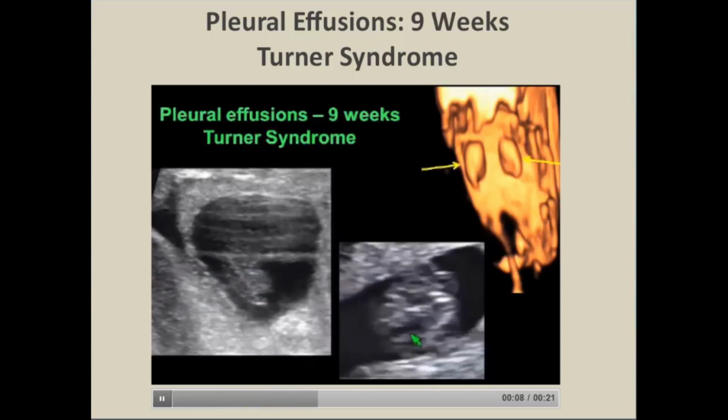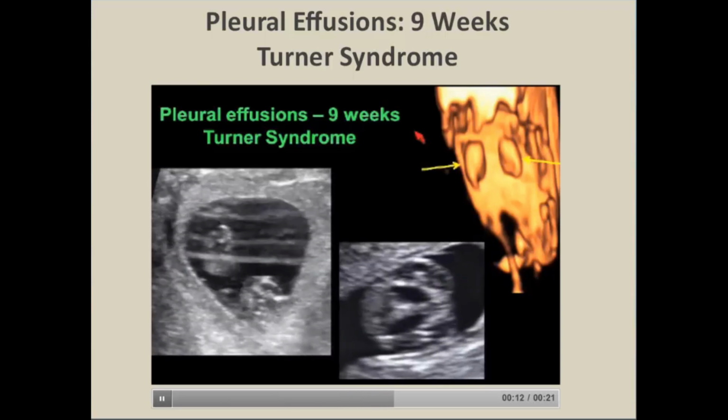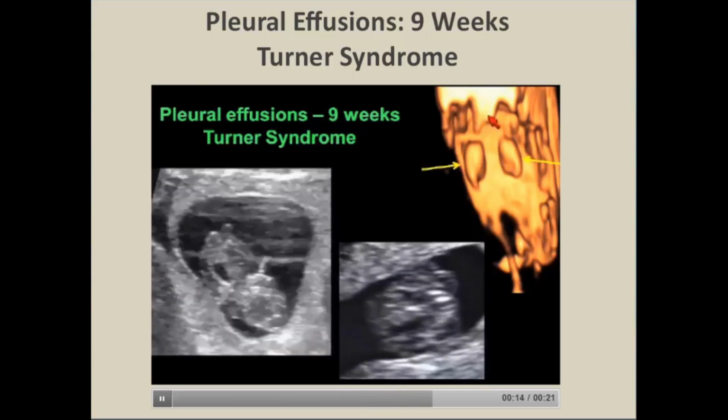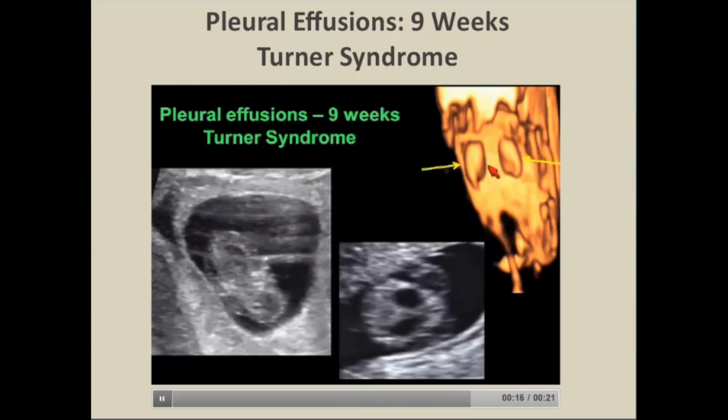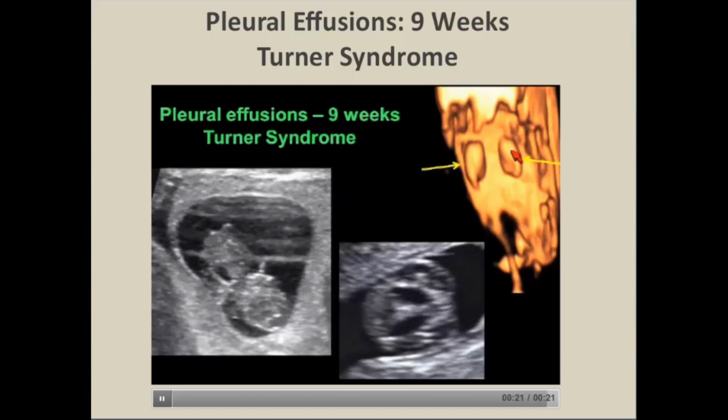On a transverse view of the chest, you can see the heart with big pleural effusions. This is actually the inversion mode of the fetus, showing how much fluid there is in a chest, cast on the 3D, just outlining the fluid in the fetus.